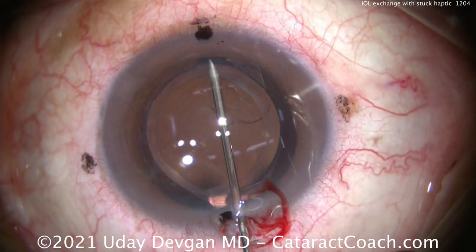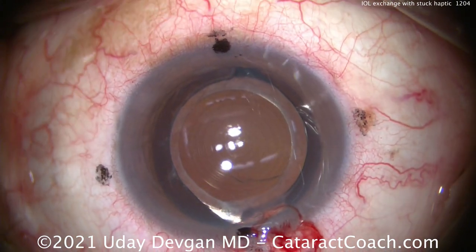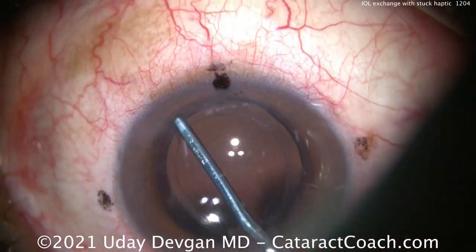We're getting a 27 or 30-gauge needle and putting the dispersive viscoelastic on it, injecting a little bit underneath that rim. There you go.